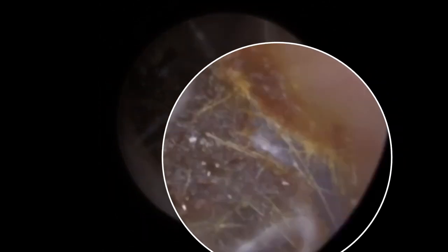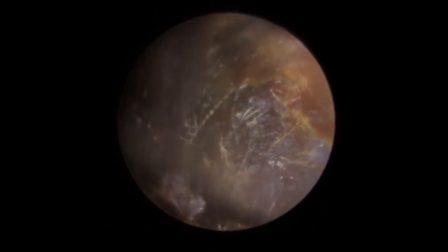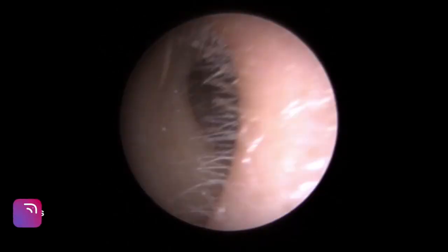Just to give you some idea, I'm going to slow down this next one and blow up that particular portion. That's the eardrum — that blue line you can see running around the edge. So this wax is pushed right up against that. They really forced this in and that's what's been causing the hearing issues. So I'm really gently trying to pull this down from the top section. We're going to try the Jobson horn out — you can see what I mean now about it being a bit too wide. The width of that front end of the Jobson horn is just too thick to get into that little tiny gap at the top.